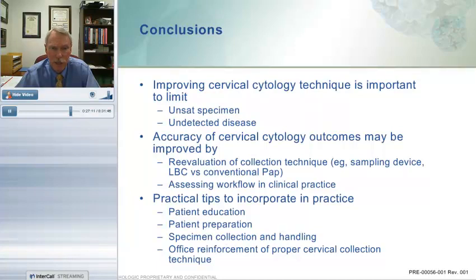Monitor your processes for specimen collection and handling, and reinforce with your office staff the proper cervical collection technique. I suspect that this frequently would center on having your aide, who may be swishing your brush, your spatula, or your broom, do so the full 10 times and press it against the sidewalls of the container so that you collect the cellular material that was picked up with the brush.